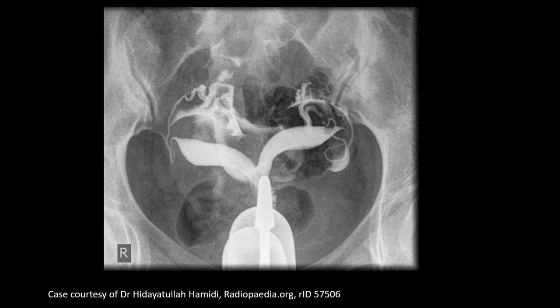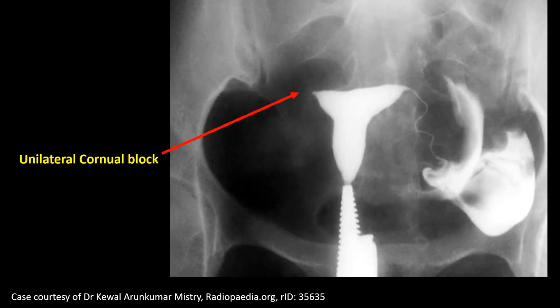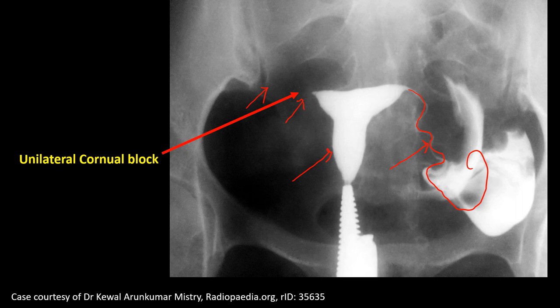In some cases, as seen in this image, you can see the uterine cavity is divided — this is a congenital anomaly known as a bicornuate uterus. In another image, you can see the shadow of the uterine cavity and the shadow of the left fallopian tube, where the dye has passed and spilled into the peritoneal cavity. However, the shadow of the right fallopian tube is absent, meaning the right fallopian tube may have a blockage. This condition is known as a unilateral cornual block.